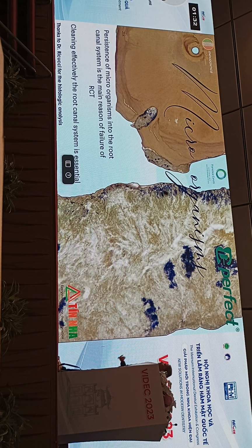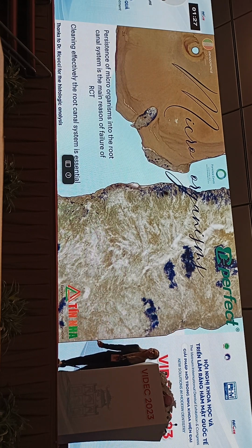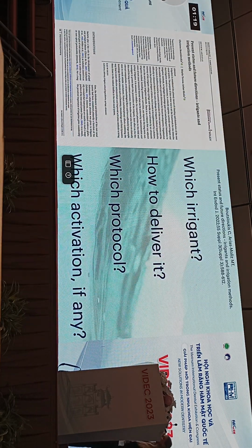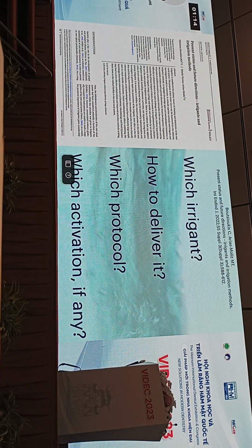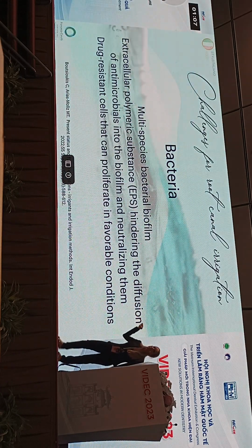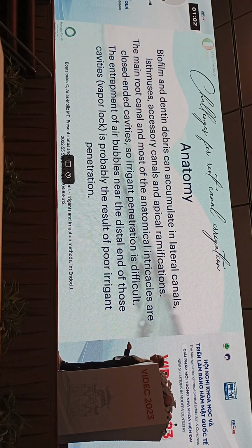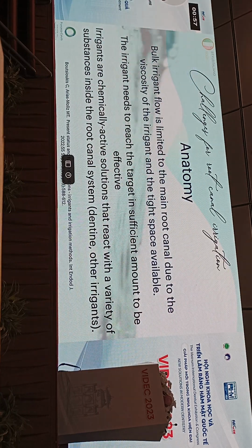And we have to remember that we are fighting against these kinds of things, against microorganisms that can hide inside dentinal tubules. So we need to clean effectively. And this is a nice article. Now I'm going quick because we have little time, but this is going to tell you which irrigant, how to deliver it, and which protocol to follow. Because we are fighting against drug-resistant bacteria in tight spaces. So we have to deliver the irrigant in an efficient way if I want it to work.